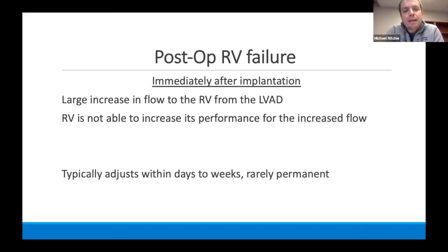There's something unique, and again, you won't be dealing with this unless you go to a VAD center and start working in the ICU, but oftentimes there's a high percentage of these patients immediately post-op that go into RV failure. And this happens immediately after implantation. So much of the time spent pre-op deciding whether or not they should get a VAD is determining if their RV can support the new amount of flow.